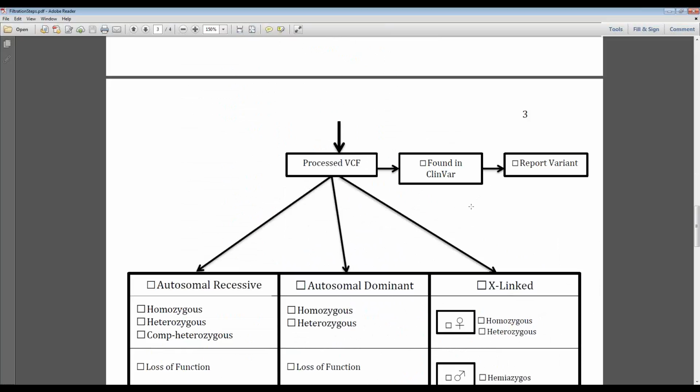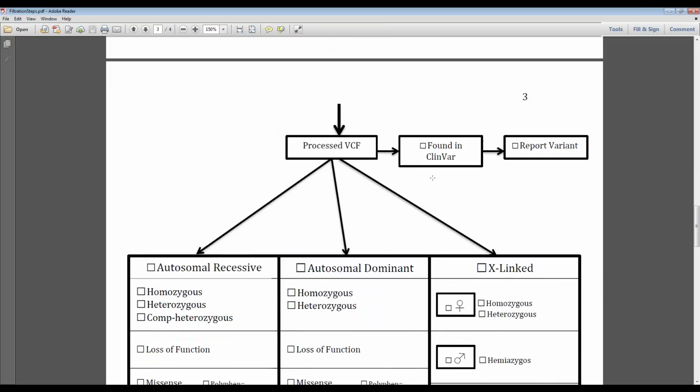And then we just make sure this variant is pathogenic. It's really related to the disease or the phenotype of this individual. And if we are satisfied with the classification, there's enough evidence about this variant, this VCF file, this sample, literally will take 5 minutes. It will be reported in 5 to 10 minutes. And then you're done. Then you can move on to the next sample.